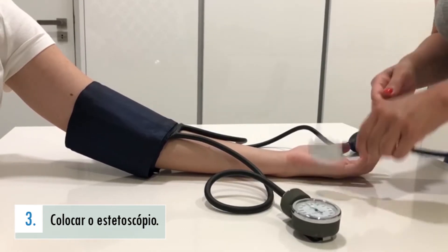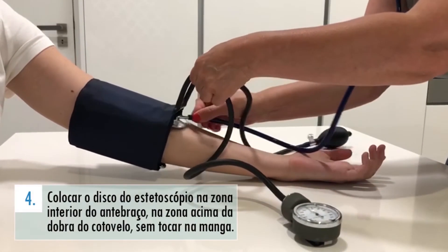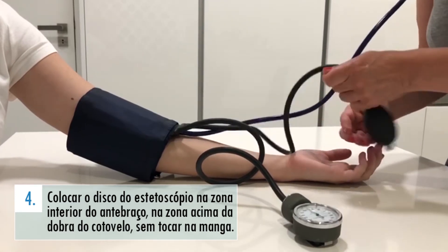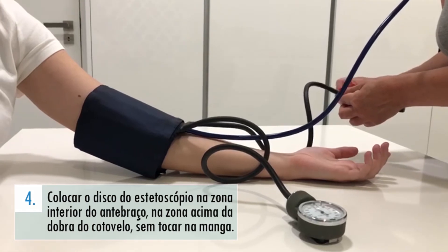A pessoa que o está a ajudar deve colocar o estetoscópio. De seguida, essa mesma pessoa deverá colocar o disco do estetoscópio na zona interior do antebraço, acima da dobra do cotovelo, sem tocar na manga, e verificar que o parafuso da bomba da borracha está fechado.